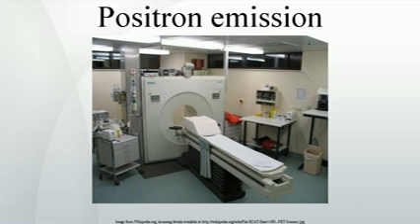It soon became clear to many of those involved in PET development that a circular or cylindrical array of detectors was the logical next step in PET instrumentation. Although many investigators took this approach, James Robertson and Zang-Hee Cho were the first to propose a ring system that has become the prototype of the current shape of PET. The PET-CT scanner, attributed to Dr. David Townsend and Dr. Ronald Nutt, was named by Time magazine as the medical invention of the year in 2000.